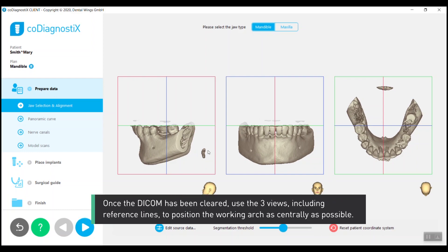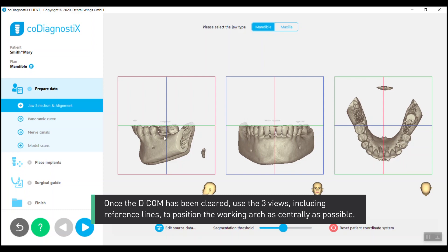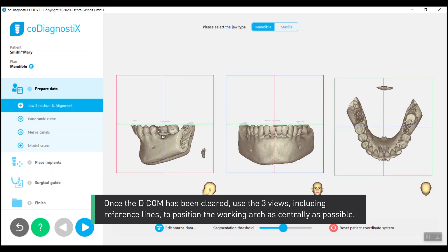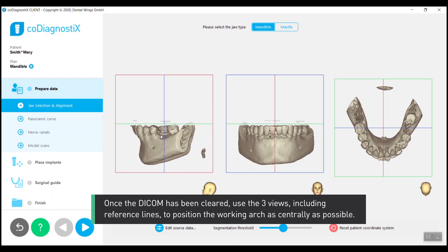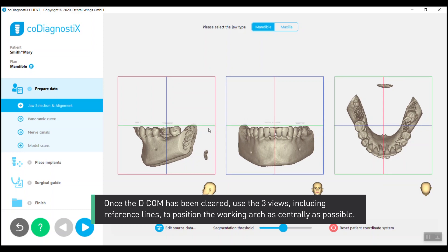Once the DICOM has been cleared, use the three views, including reference lines, to position the working arch as centrally as possible.